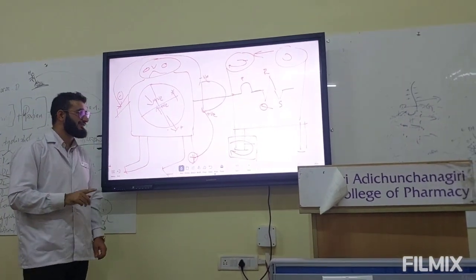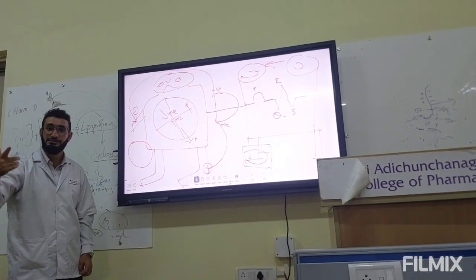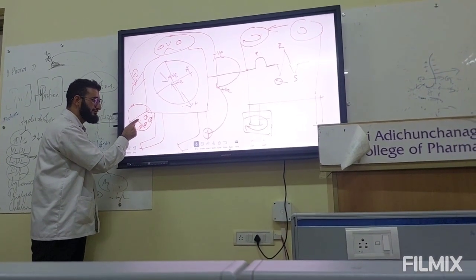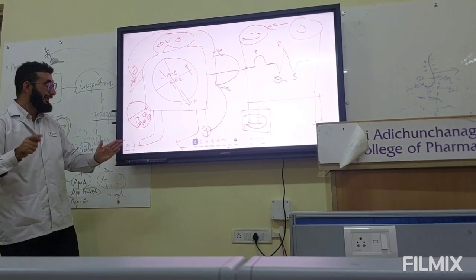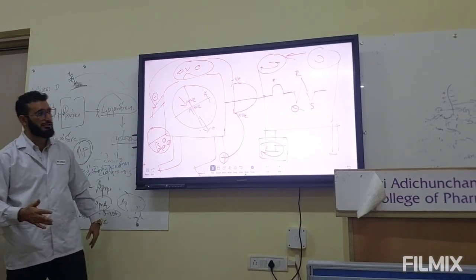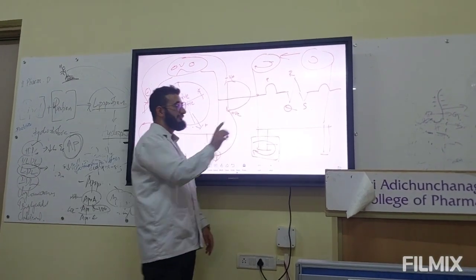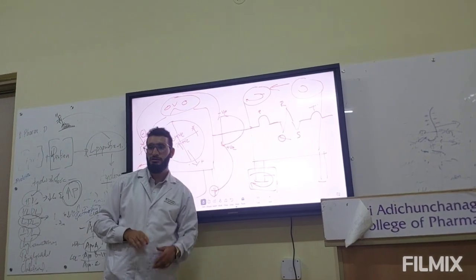Lastly, I told you the part which depolarizes last will repolarize first. Repolarization is negativity like this. These negative currents move towards the negative terminal, so the deflection will be positive. Repolarization is slow and gradual compared to depolarization, so there will be a gradual and slow deflection in the galvanometer. Which wave is this? T wave.